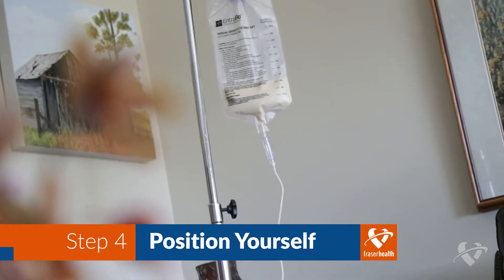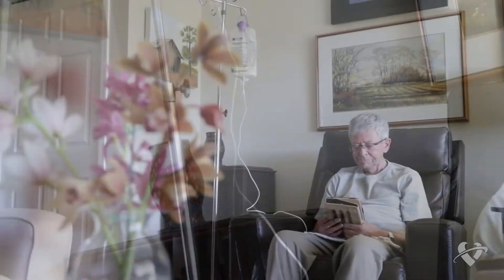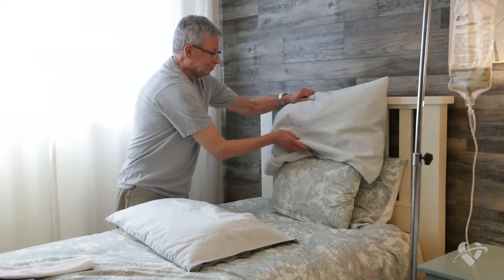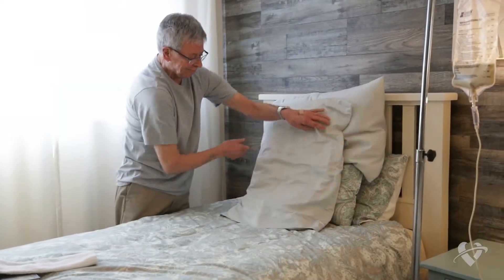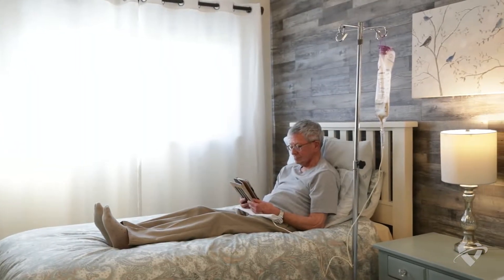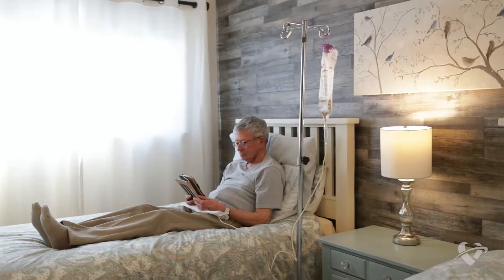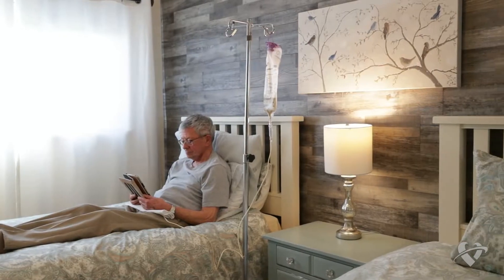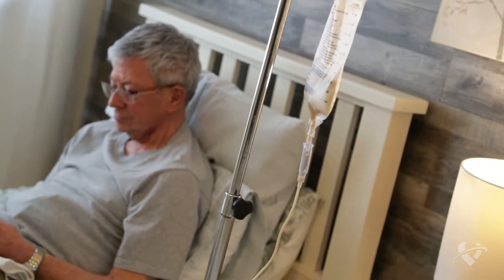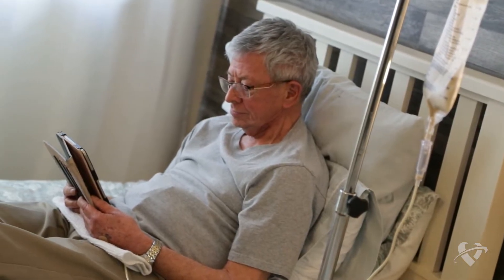Position yourself to be upright during feeding. Whether you sit in a comfortable chair or at a kitchen table, the idea is not to be lying flat. If you are in bed, use pillows to prop yourself up to at least a 30 degree angle. Try not to slouch or lie flat as this could result in formula going up into your esophagus or even into your lungs. Place the towel on your lap.